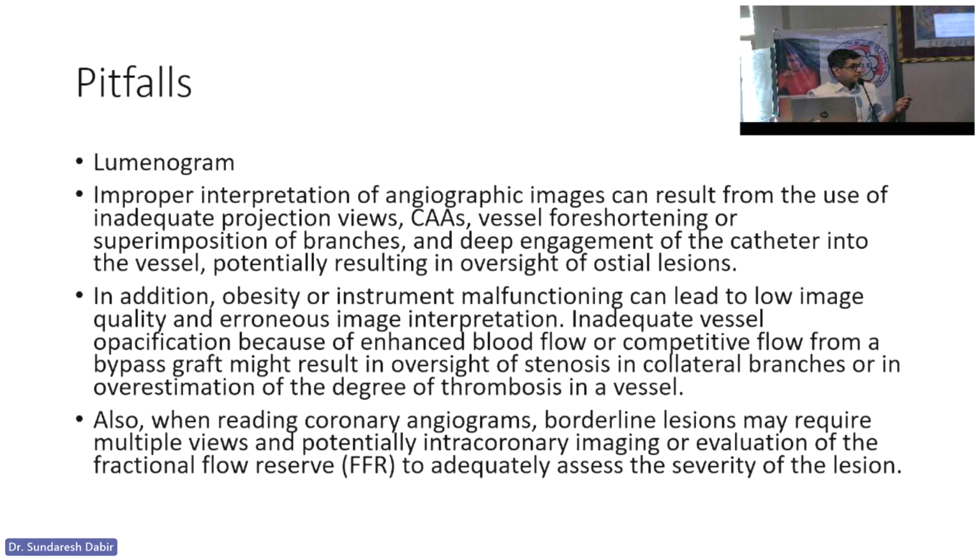So the first pitfall, the major problem of coronary angiogram, is that it's a luminogram. You're not seeing the artery from outside, you're seeing only the contrast inside. So if it's a diffusely diseased vessel whose lumen is uniformly narrow, you can think, oh, this looks normal, but it's just a thin lumen you're seeing, right? The other issues are the many views which overlap. These are all issues regarding a 2D interpretation of a 3D structure. And always remember, in someone who's very fatty, the biggest problem you get is in iliofemoral angiography. You try to take an iliofemoral, and they're like, all Indians, we're all fat, we have abdominal obesity. You'll see nothing even if you go 15 frames, okay?